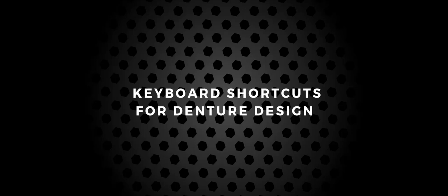Hey guys, I thought I would just share some of my keyboard and mouse shortcuts for when I'm designing digital dentures in 3Shape.